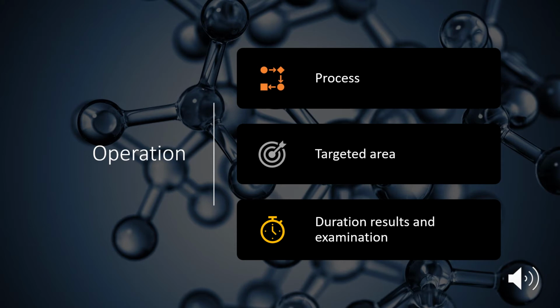How does the X-ray happen? There are special digital X-ray detectors located directly opposite of the X-ray source. The X-ray source passes through the patient's body to collect all the data needed, and then it is transmitted to the computer.